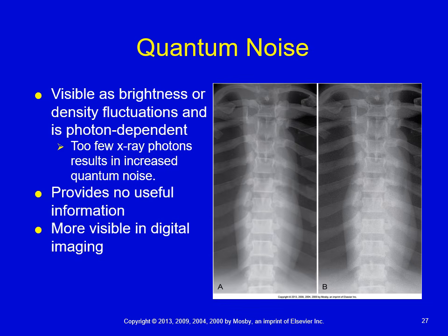So the same thing applies with noise. If noise is present, you must repeat it. There's no amount of windowing or leveling you can do post-processing to fix it. You have to repeat it.